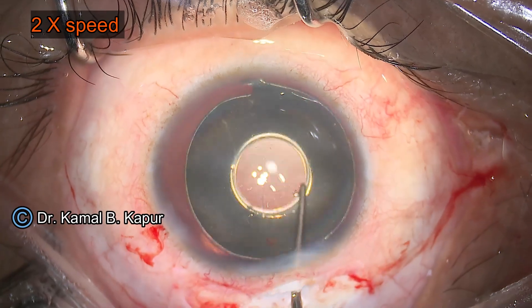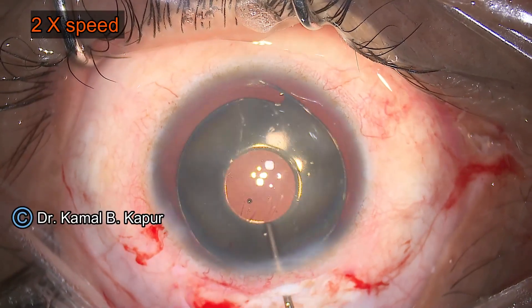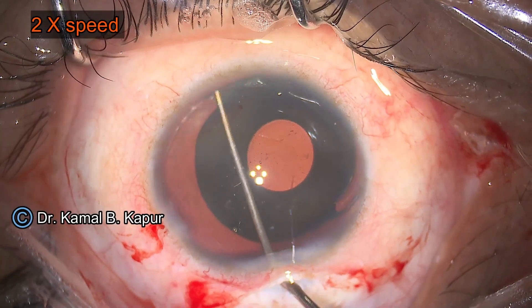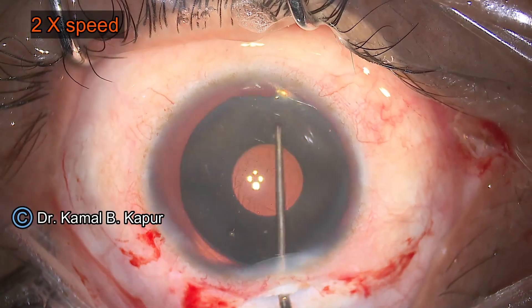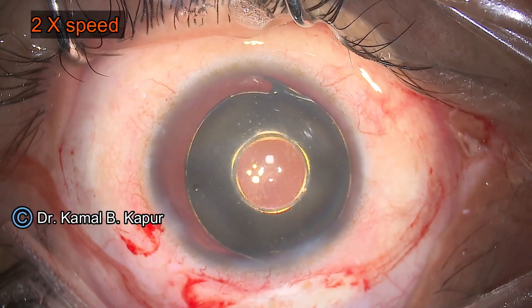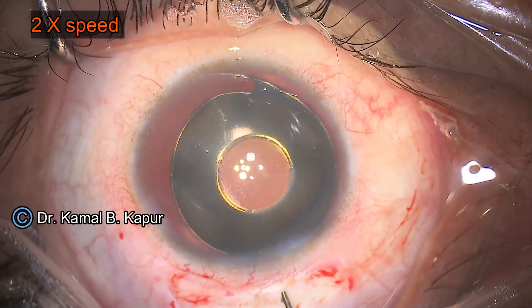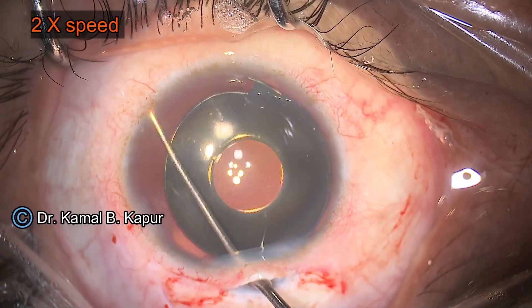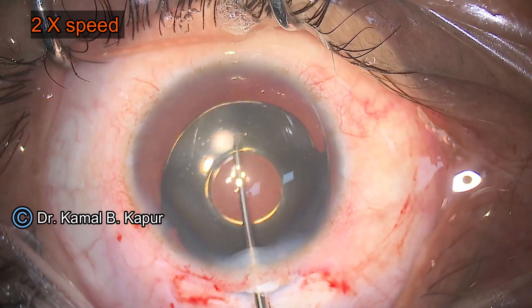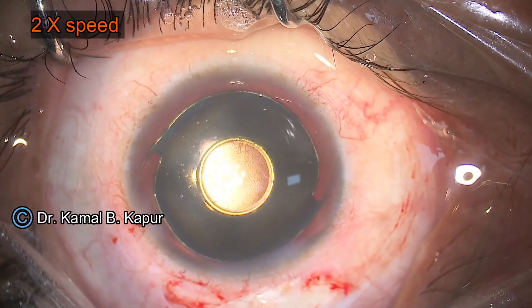With a slow, gentle dialing movement, we ensure that the trailing haptic is now into the bag. As mentioned, as the leading haptic goes into the bag, the trailing haptic may come out — this is a common situation with PMMA haptics. You need to ensure the downward depression force on the haptic is minimal, otherwise the opposite haptic will peep out of the bag. You can use the eyelet on the haptic to manage and place the lens inside the bag.